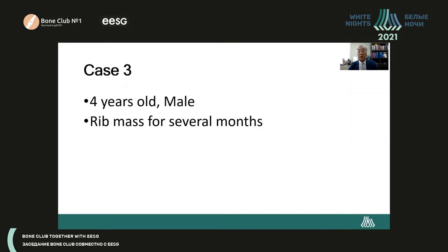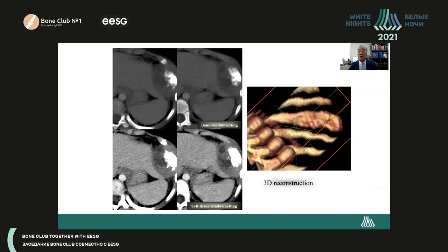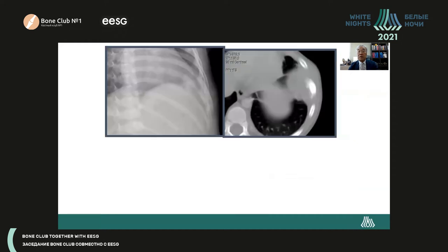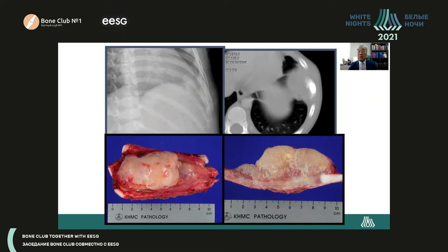Case number three is a four-year-old boy whose mother noticed a mass. AP and left oblique views of the left thorax show bone destruction of the left seventh rib with a periosteal reaction of sunburst appearance and bony sclerosis. CT axial image shows diffuse thickening of the rib with periosteal reaction of sunburst appearance and diffuse sclerosis. The rib region shows soft tissue mass formation with heterogeneous density, and the adjacent rib is compressed. 3D reconstruction shows irregular contour of the left seventh rib. The rib was resected, and the cut surface shows a fish-flesh appearance; the extraosseous mass is far larger than the intraosseous mass, which is a characteristic feature of Ewing's sarcoma.